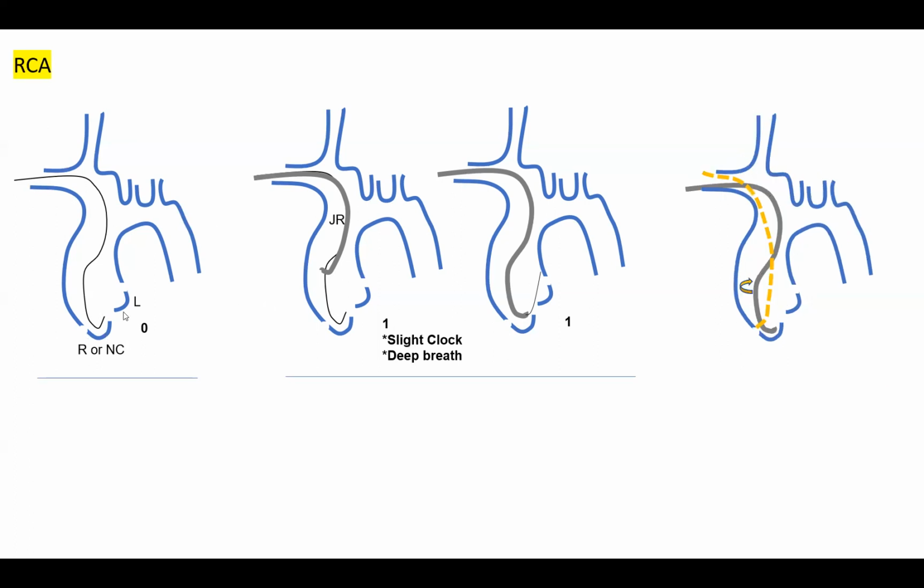And in your brain, you always imagine the lower cusp is right or NC, and the higher cusp is left. You have to always imagine in your brain as you're engaging and maneuvering: right cusp, left cusp. You always draw it in your brain. Anyway, your wire falls onto the right cusp.